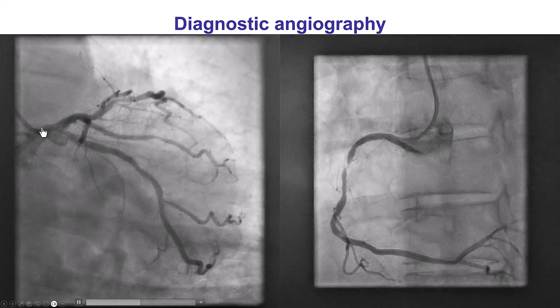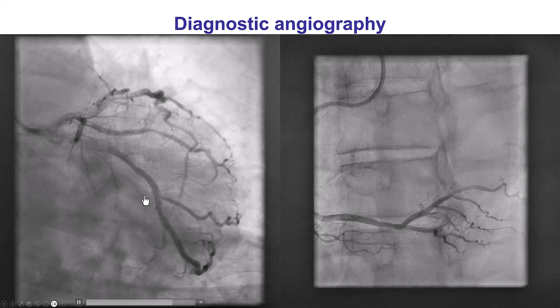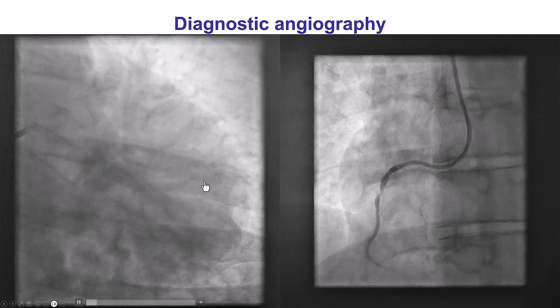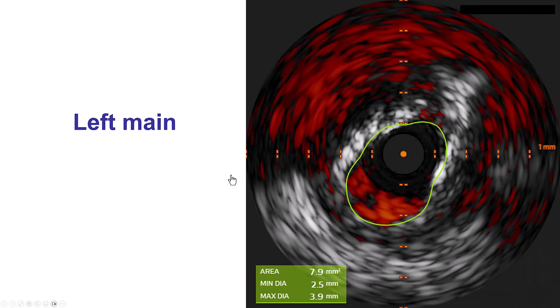There were also some intermediate lesions in the LAD and the left main. To make sure, we did perform an IVUS of the left main, and the area was 7.9 mm². Therefore, the left main, as the CT had indicated, was not significantly stenosed.